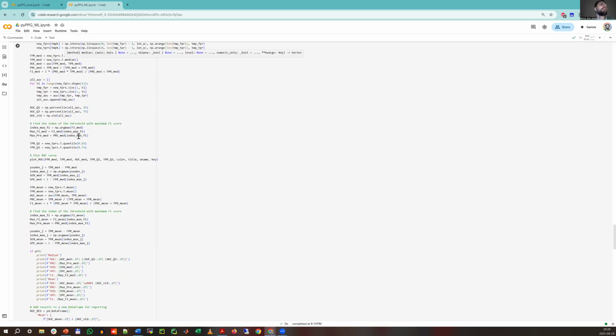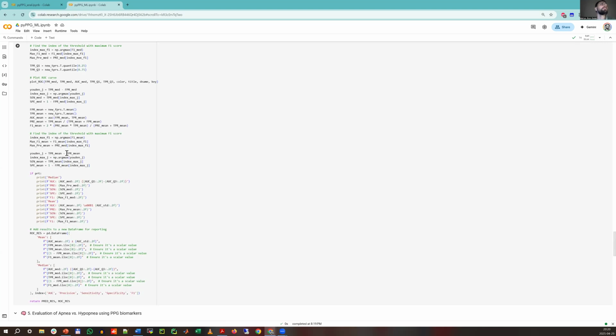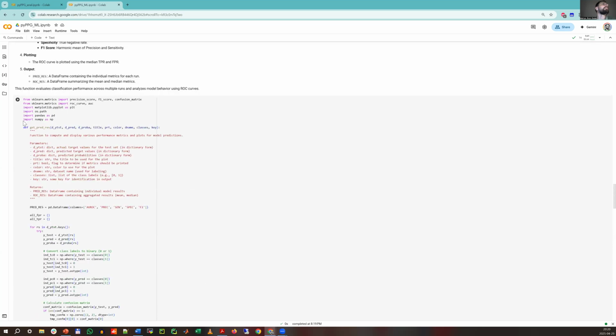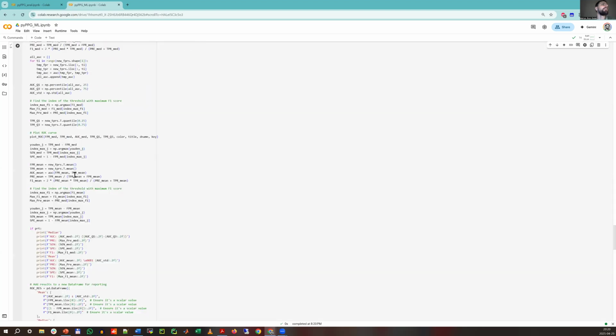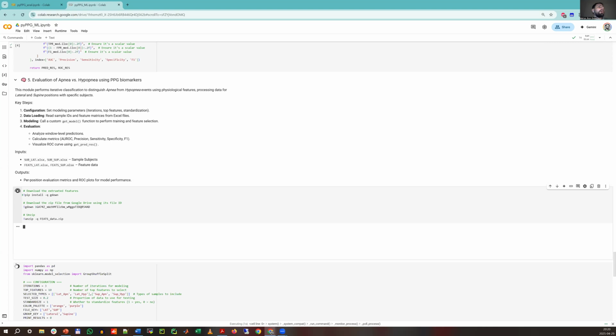Here are each module where we calculate the median or precision stored. And the final section is the evaluation itself. I have to run this section also. Okay. We can just use the function. So the last module is the evaluation itself. We want to know how the apnea and hypopnea classification works.